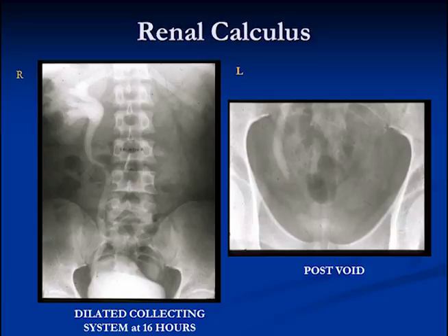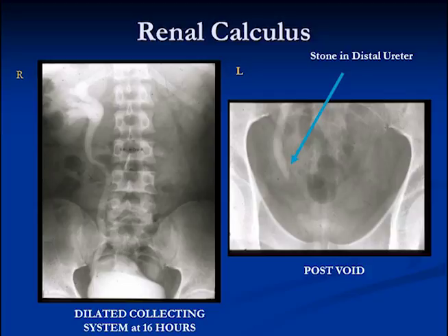This shows the left kidney is normal — there's almost no contrast left in it. On the right side the kidney is dense, with dense opacification of the pelvic calyceal system and ureter right down to the bladder. This is a 16-hour film — it takes 16 hours for the contrast media to collect in that collecting system. When we get the patient to void, the post-void film shows complete interruption of the distal ureter on that side, because there's a stone in the ureter — you can't see the stone itself because contrast is around it, but this implies a stone at that level.